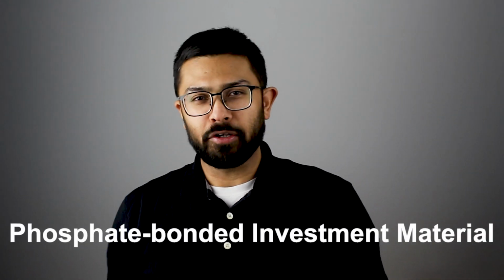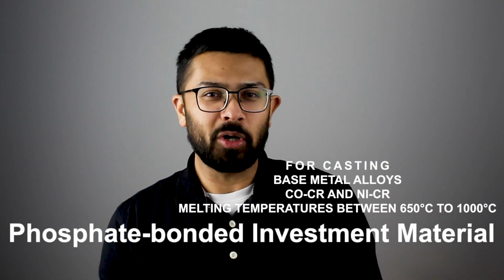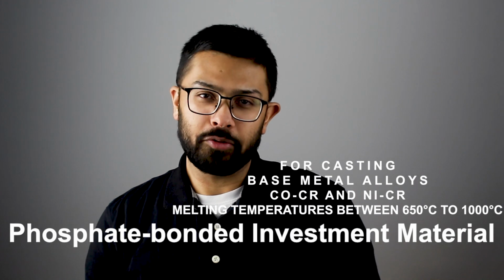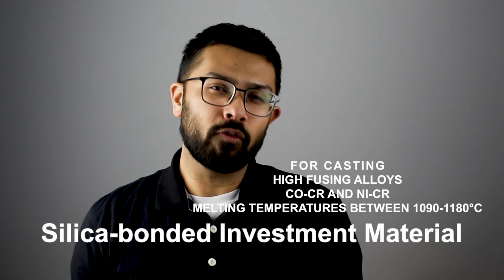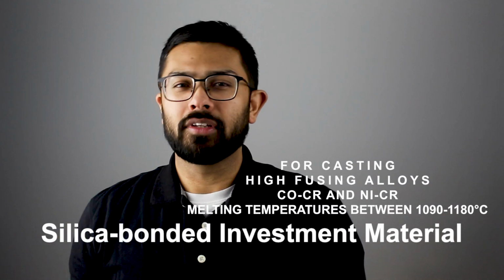thermal expansion. The next type of investment material is phosphate bonded investment material, which is designed for casting base metal alloys like cobalt chromium and nickel chromium, which require high temperature resistance. And then the third type is silica bonded investment materials, which are used for high fusing alloys and removable partial denture frameworks. Each type has specific thermal expansion properties, ensuring that the final casting compensates for shrinkage and maintains accuracy.